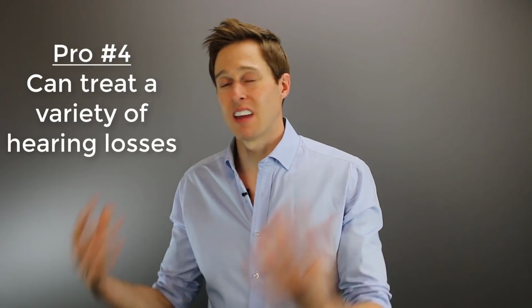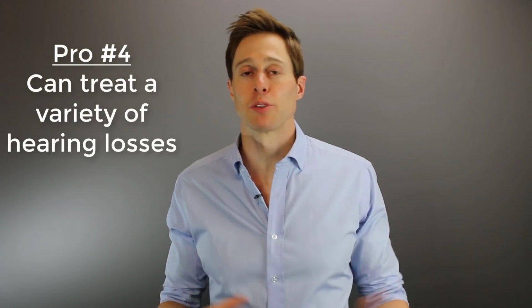Now, pro number 4 is that you can fit almost the same kinds of hearing losses with an in-the-ear device as you can with a behind-the-ear device.